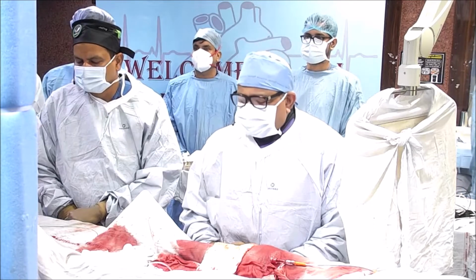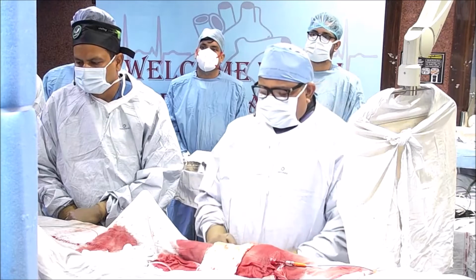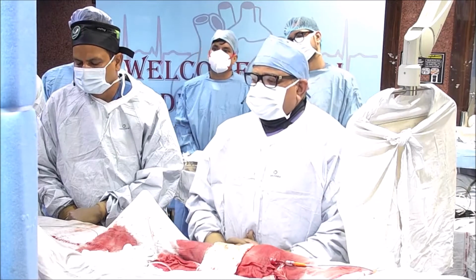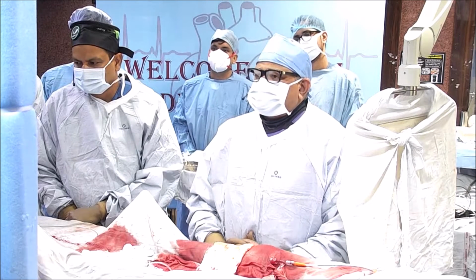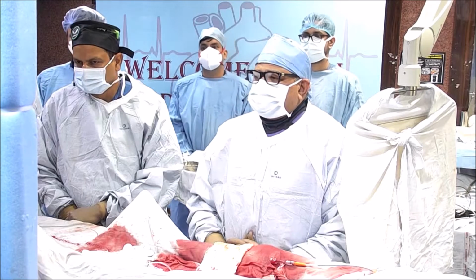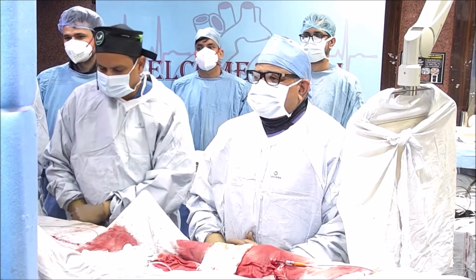What about you? I think it's enough debulking. Go ahead and stent it. Okay, so you want more debulking. No. It's already debulked enough. So you have to choose your best stent. He has shown a nodule there. Oh no, nodule is not that big. No, nodule is quite big. Do you think this nodule is going to go away with just a stent?